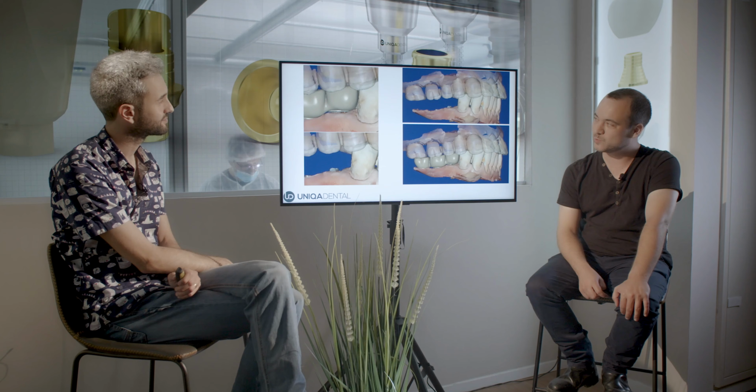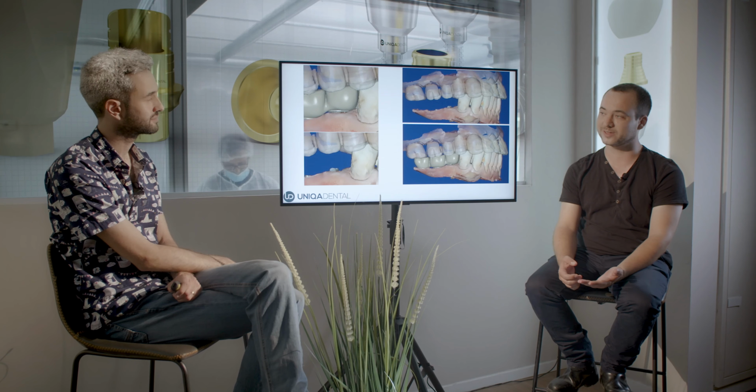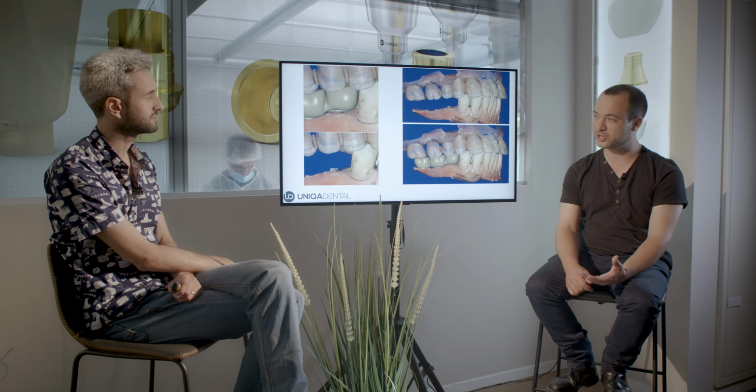What else do we got? When you took impressions on a multi-unit level, in CAD CAM you can change the multi-unit digitally. You don't have to change it manually. For example, if you take impressions the traditional method, and you saw in the impression that the multi-unit is a little bit higher than I would want it to be, and I want to change the height of the multi-unit, it's impossible to do it manually on the working model.